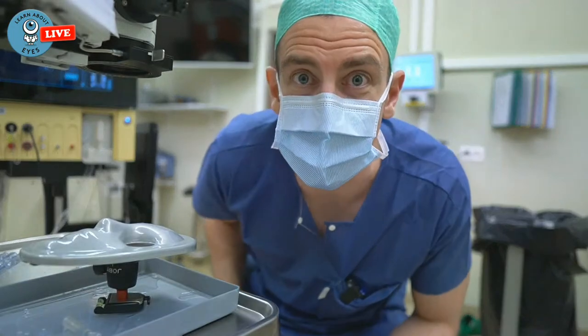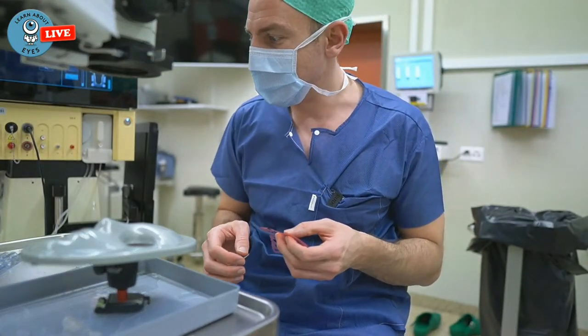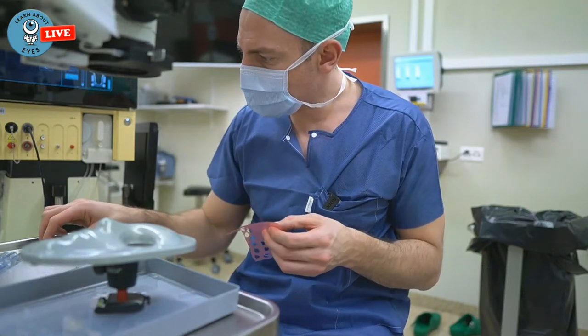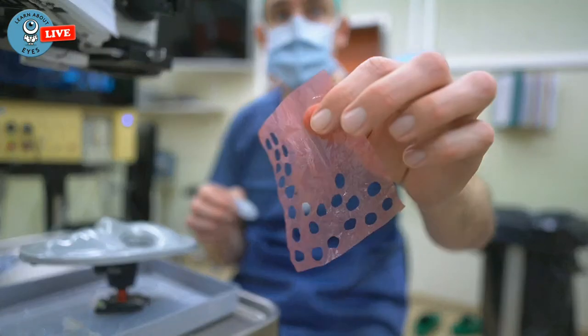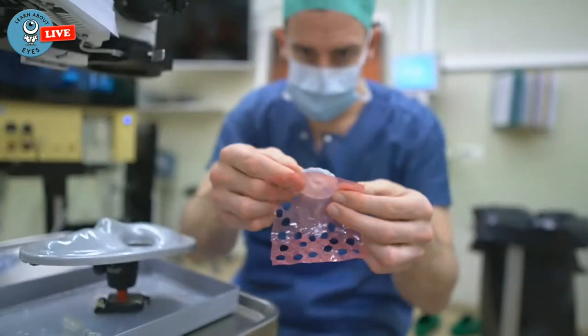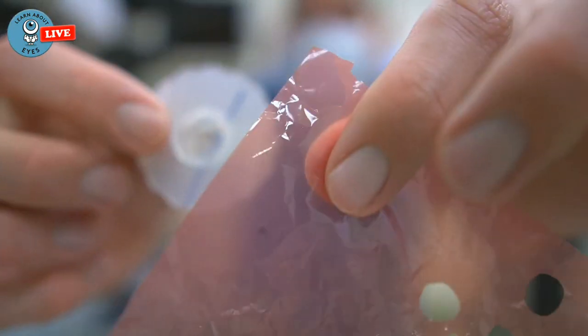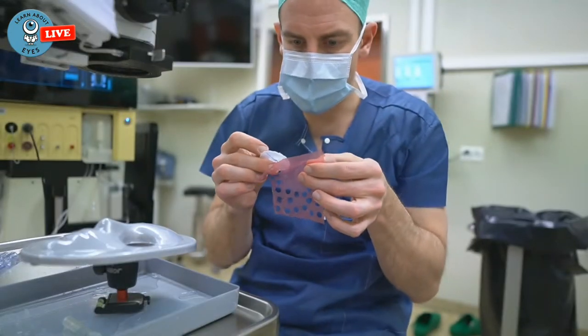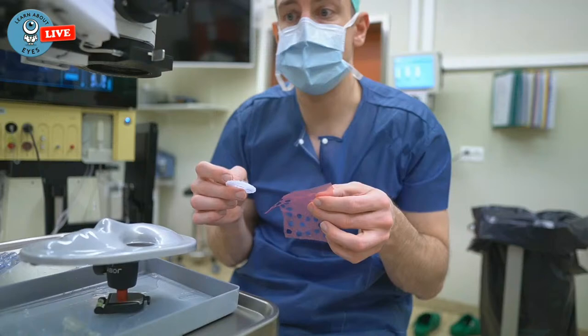Now here's the next problem. I don't have any glue. Didn't think about that. So maybe I can just punch this with the haptics. Put the haptics through this. Let's see if that works. And then create a posterior capsule opacification like that.